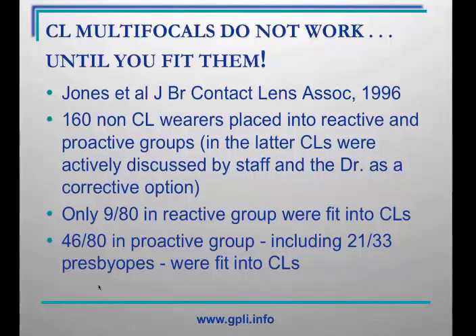So, as you can tell, only 9 out of 80 were fit in the contact lenses in the reactive group. 46 out of 80 in the proactive group were fit in the contact lenses, and knowing how profitable contact lenses are to a practice, that's enormous. And this included 21 out of 33 presbyopes.